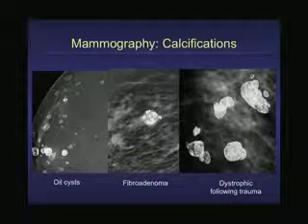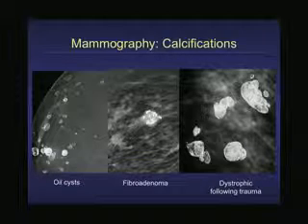When the fat liquefies, they can form little cysts, and you can get calcium around it. Calcium's just a mineral, right? This is a fibroadenoma. It looks calcifying almost in a popcorn shape, and we call it a popcorn calcification. And this patient had some trauma. So again, there was necrosis, or some of the fat in there had died, and the body's response to it is to put calcium there, okay?